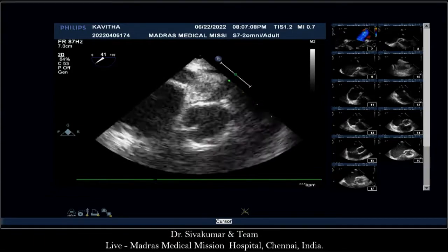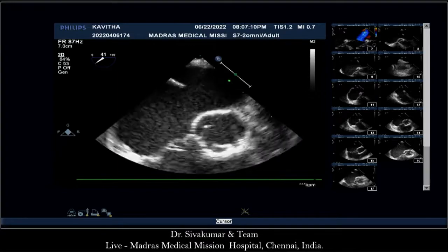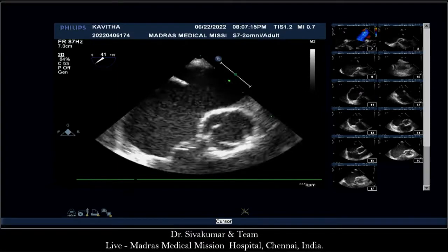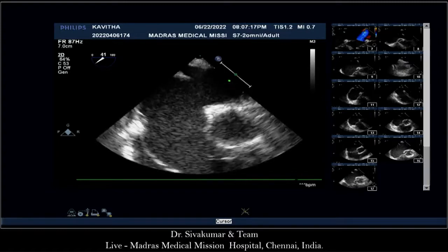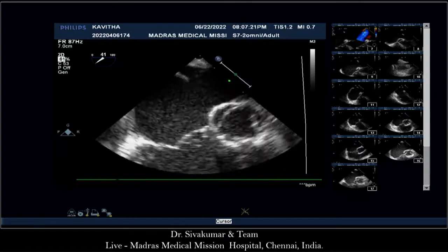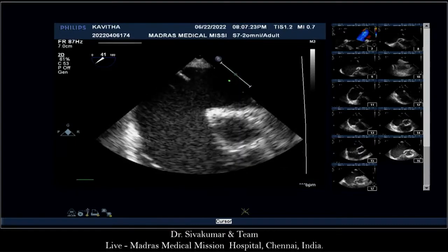I've opened a can of worms. Sorry about that. This is this malalignment towards the left atrium. When I pull out, the septum is... It's the right-left shunting that is pushing the posterior rim towards the LA. That's not malaligned.